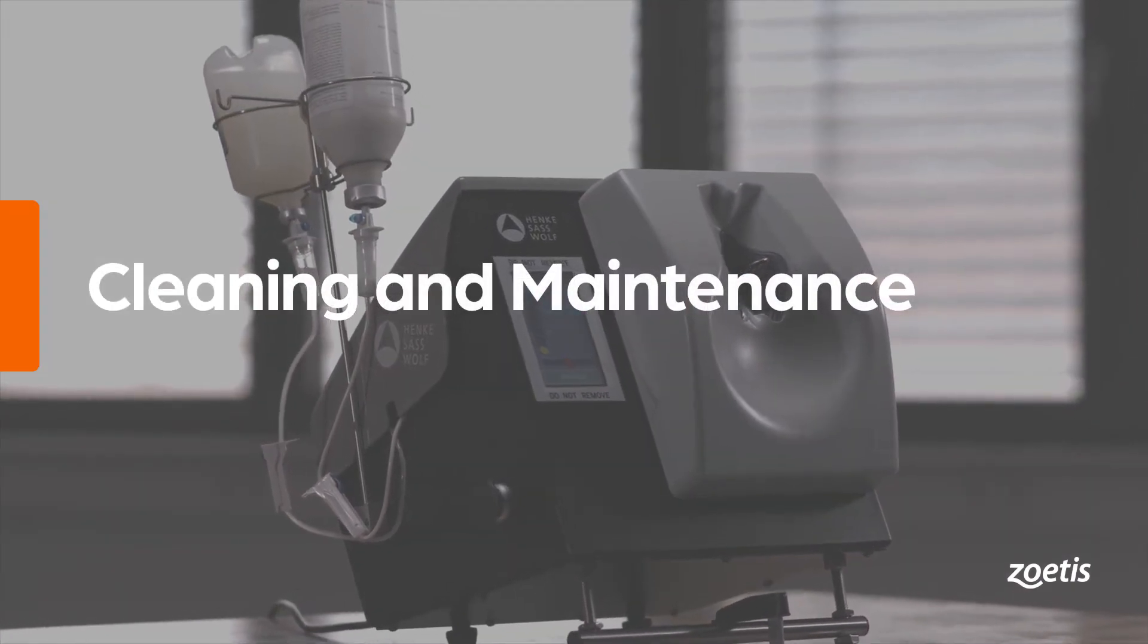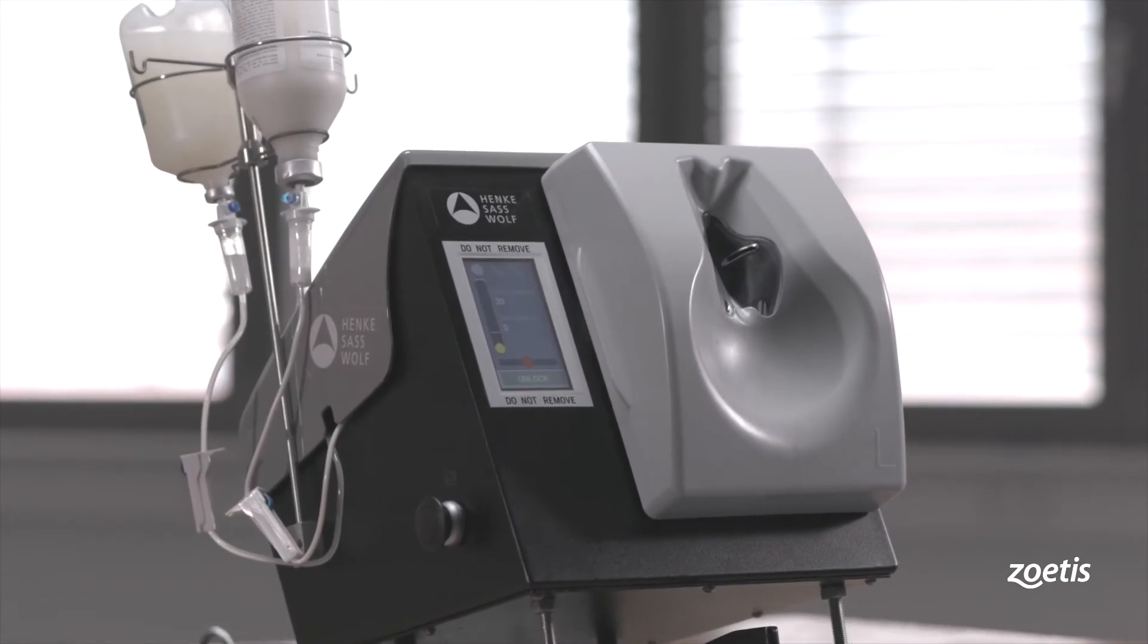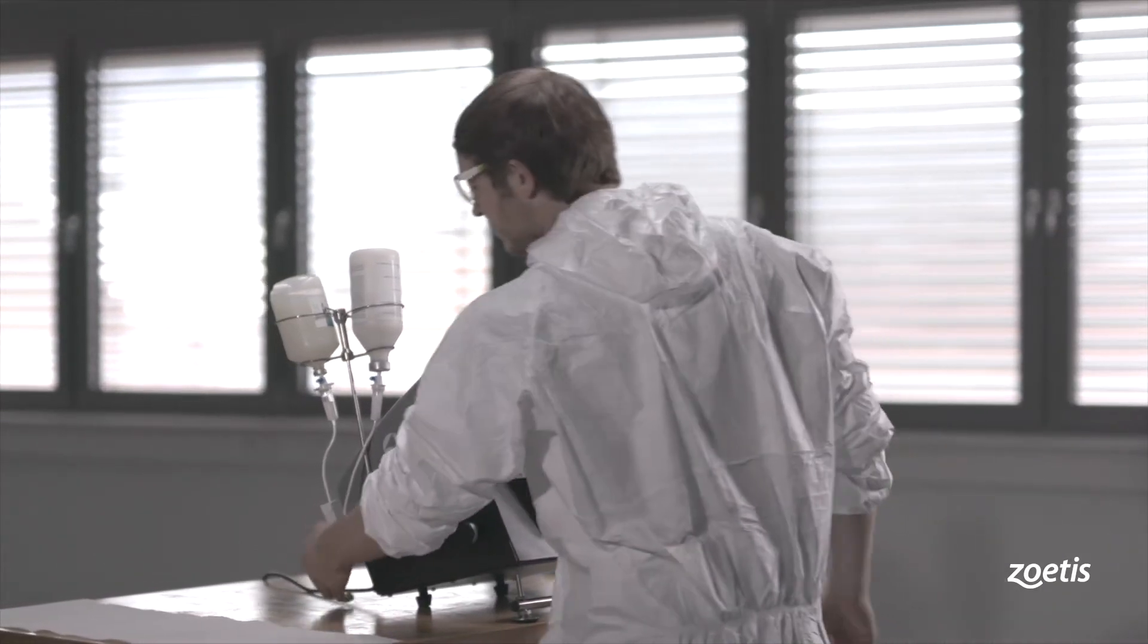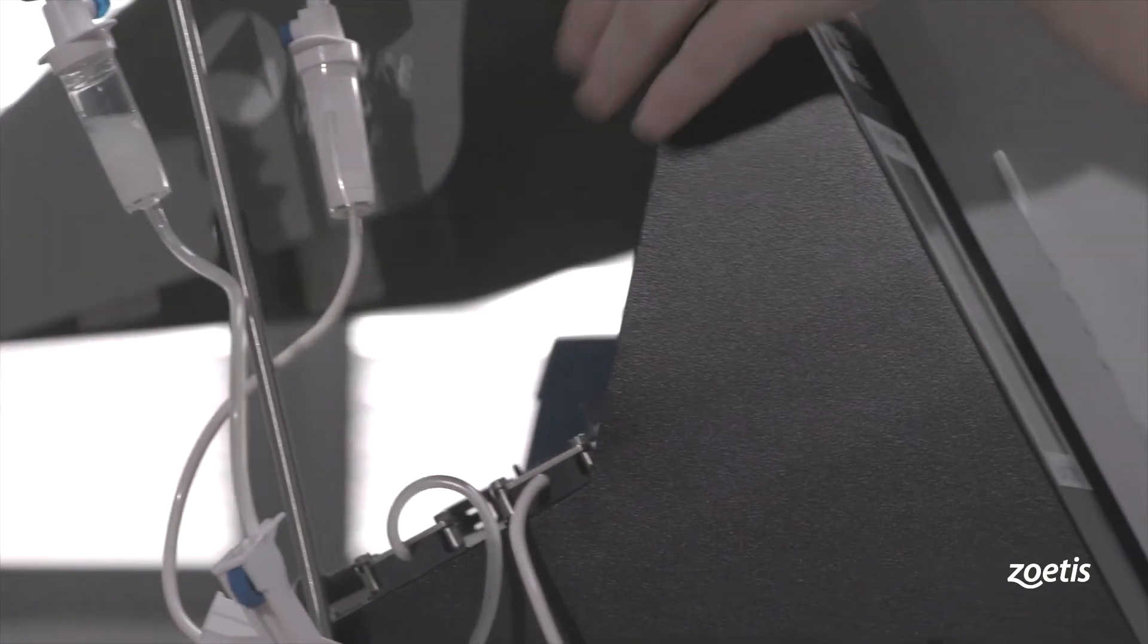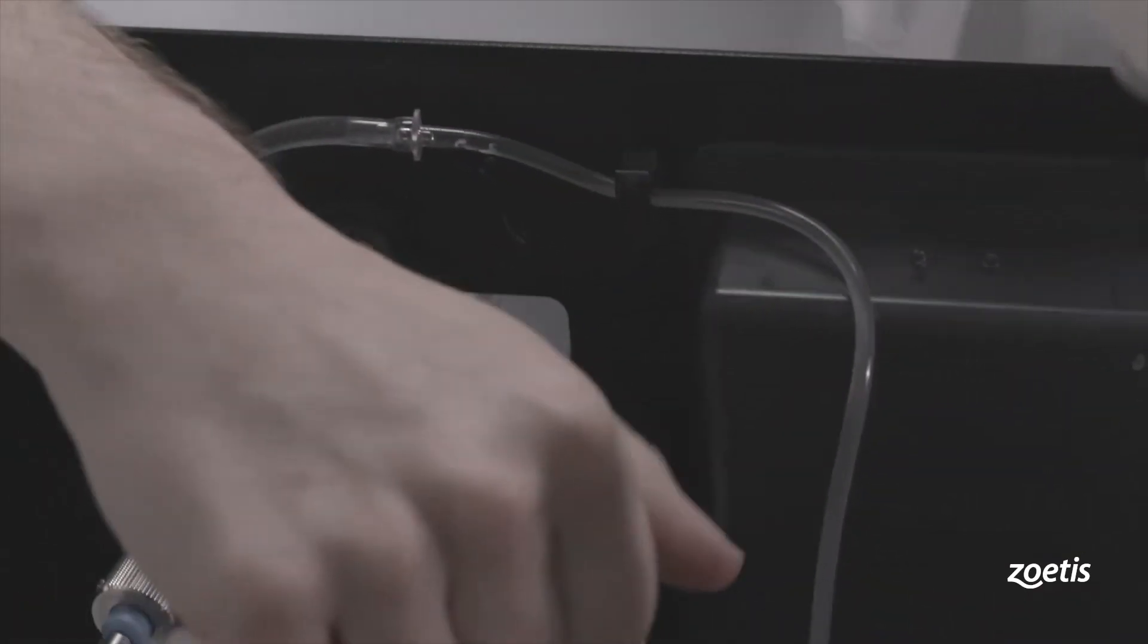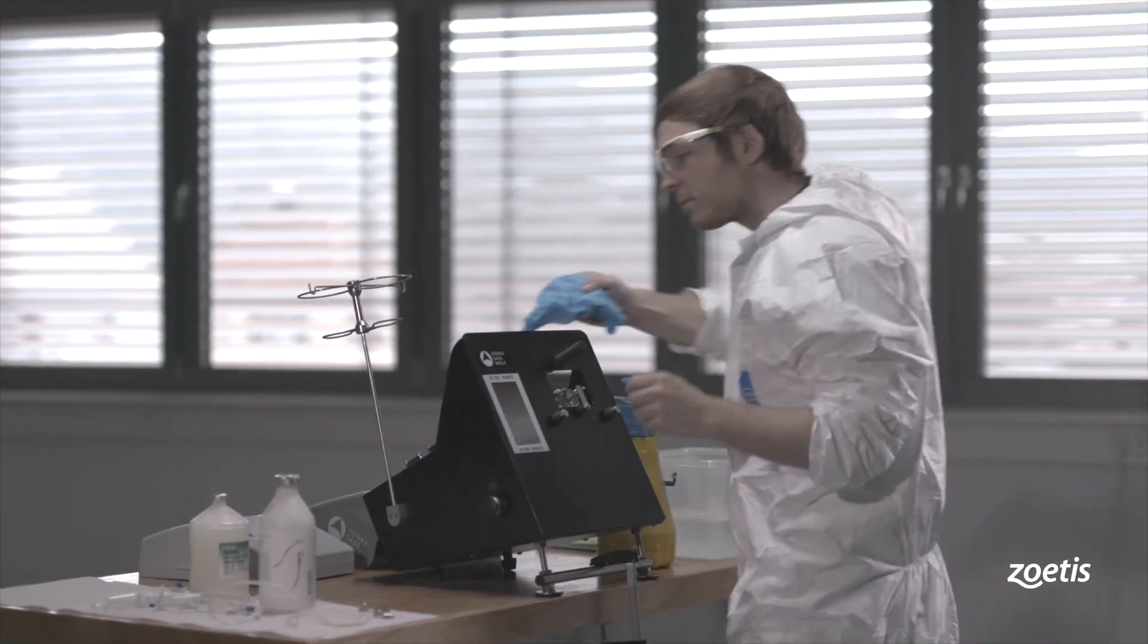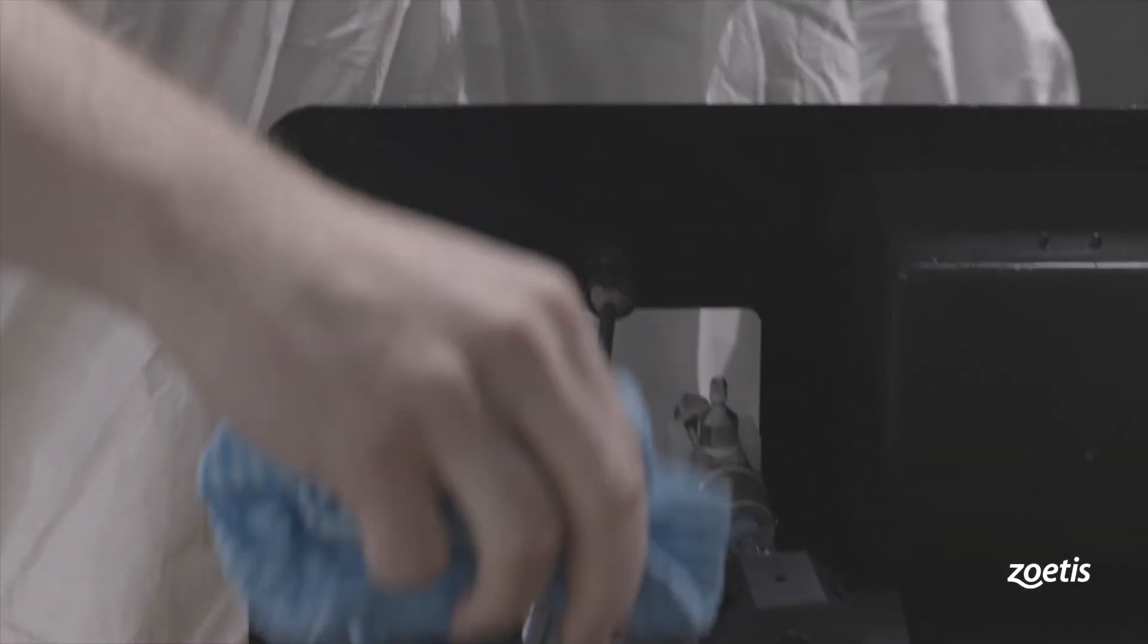After each vaccination session, clean all external parts of the device with mild soap or detergent. The device is designed to be splash-proof. Turn off the double breast vaccinator, disconnect the device from the power supply, separate the upper closure from the device, close and disconnect the vaccine supply, and remove the needles from the syringes. Wipe all surfaces with a mixture of clean water and a mild soap or detergent to remove contaminants.